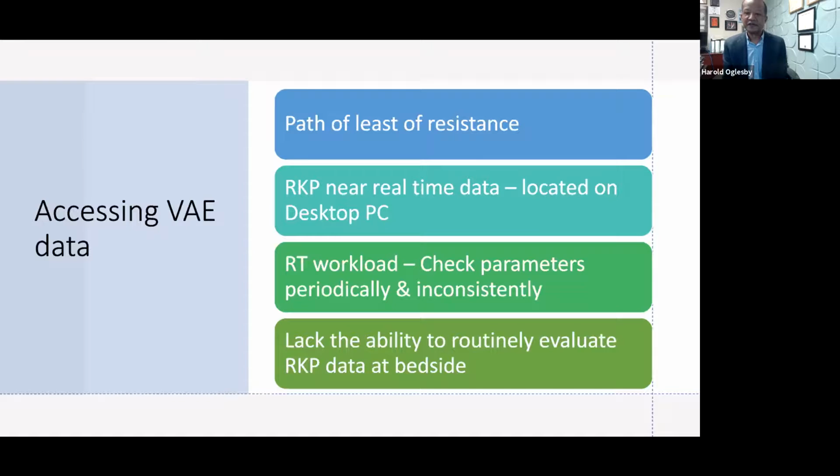They also couldn't take the desktop with them to the bedsides to review information from the RKP for these patients. And there's a wealth of information in the RKP from the ventilators as well as from our infusion pumps and medication information.